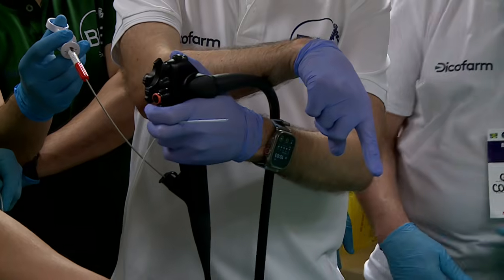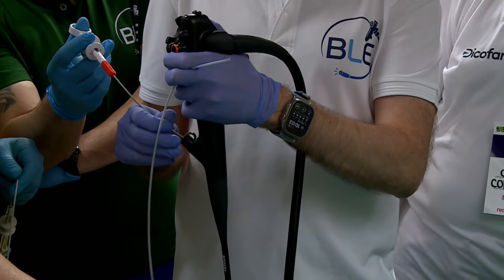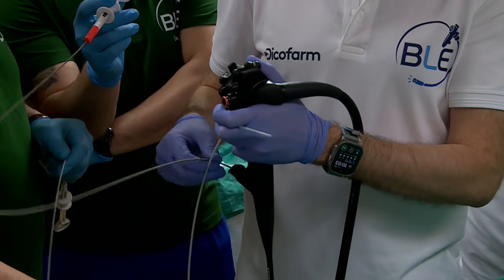Professor, yes. Don't miss the specimen. Yes, yes. We did a lot of effort. Yes, okay. So, may I take it?